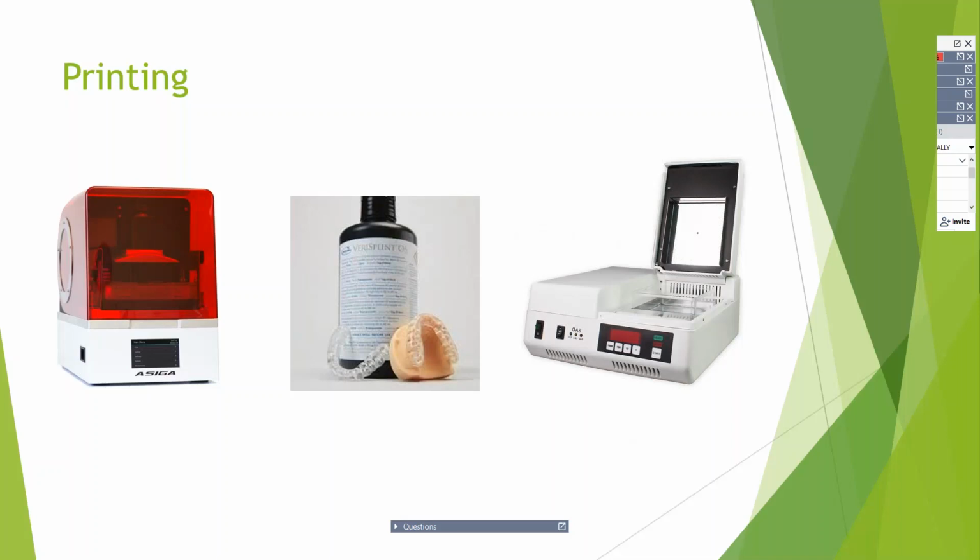Real quick, let's talk about the printing aspect. So today we're going to be discussing the Asiga Max UV385 with the VeriSPLINT resin in the Auto Flash Cure unit.